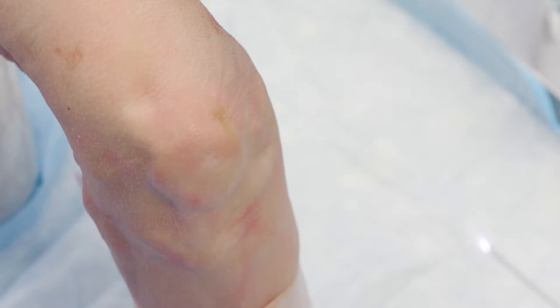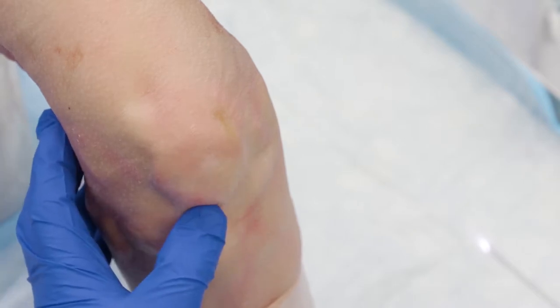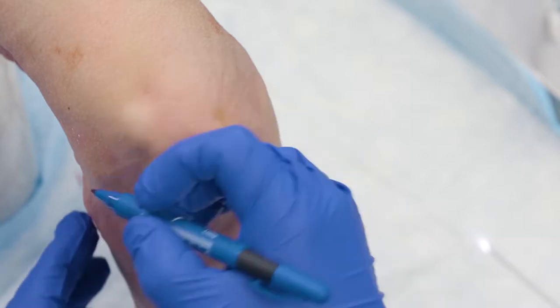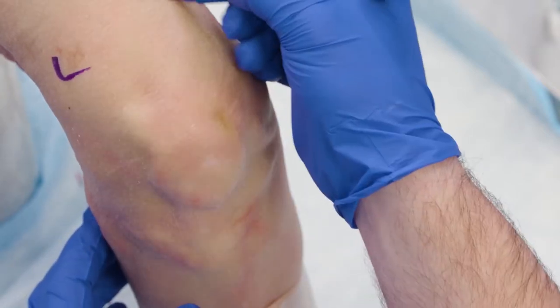Today we're going to talk about doing a knee needle diagnostic arthroscope in the office. When we're setting this up, we're really trying to think about where the patient problem is — whether their pain is more medial or lateral. For the purpose of this demonstration, this is a right knee, so here we're going to be talking about the lateral side and here we're going to talk about the medial side.